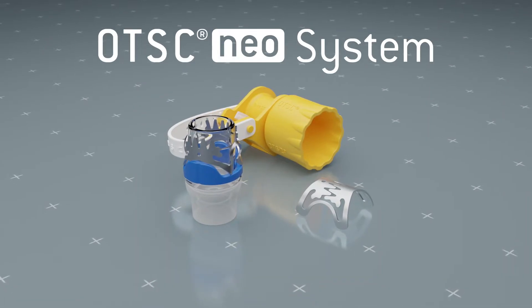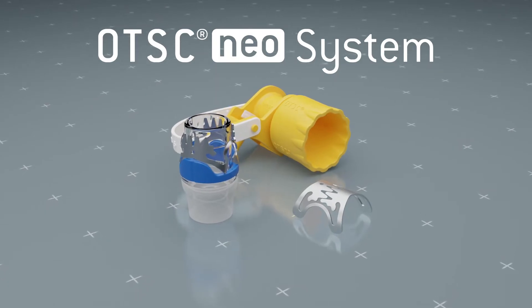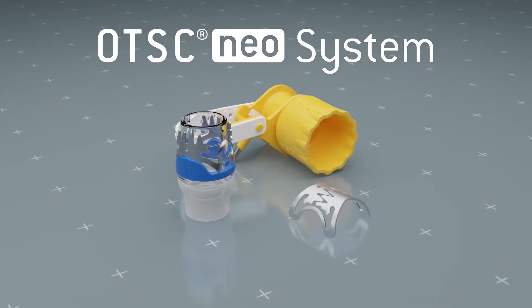The OTSC-Neo system set is an instrument for flexible endoscopy for the treatment of lesions in the gastrointestinal tract.